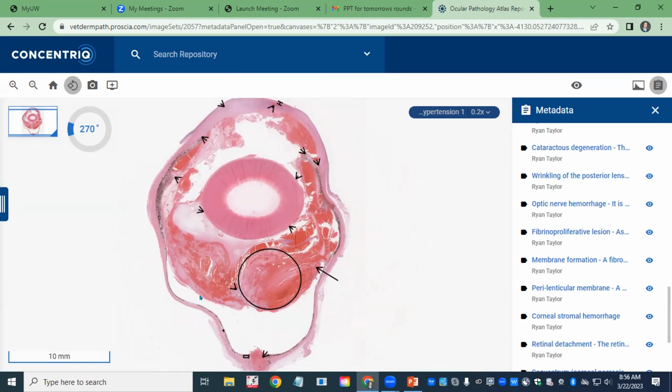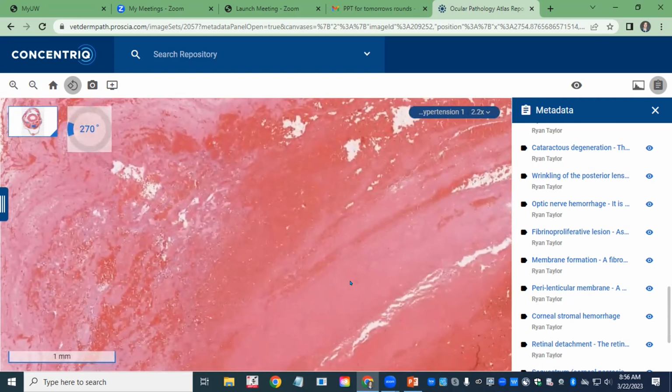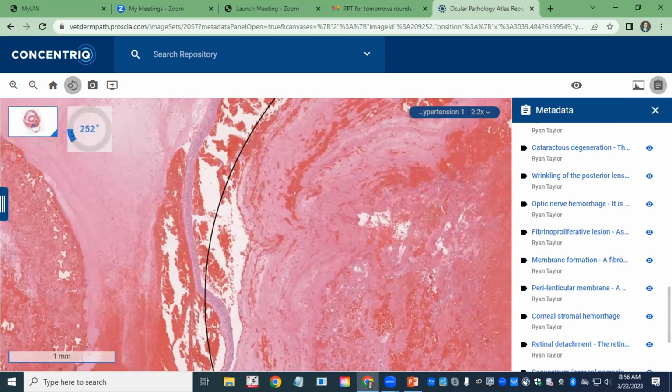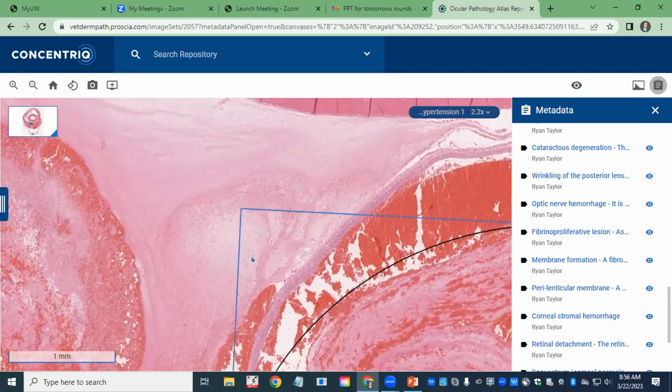But then the serum that's associated with it is more lightly eosinophilic. There's also a lot of fibrin associated with it too, we can zoom in on this area, but this is just in general. Whoa, I rotated it. That was a mistake. Now we are all seasick. All right, let's stop doing that.